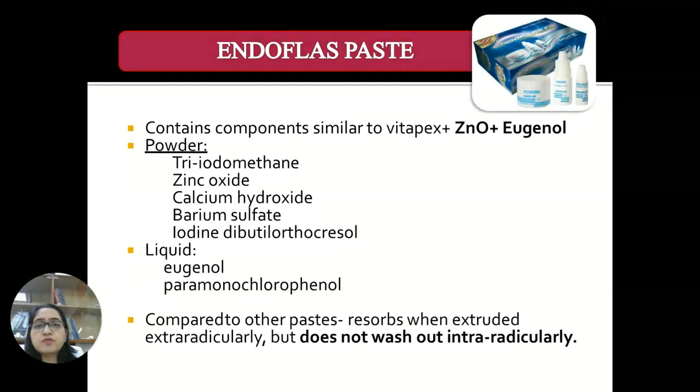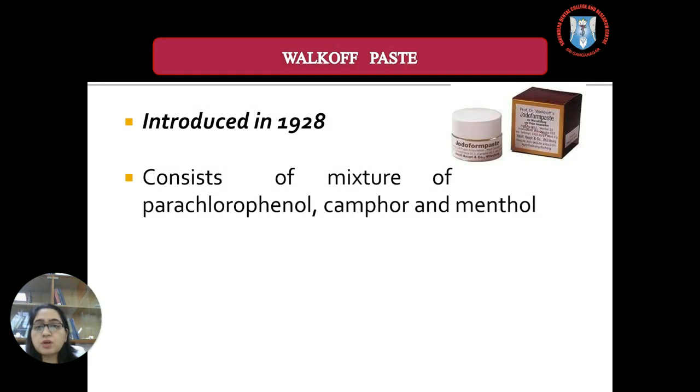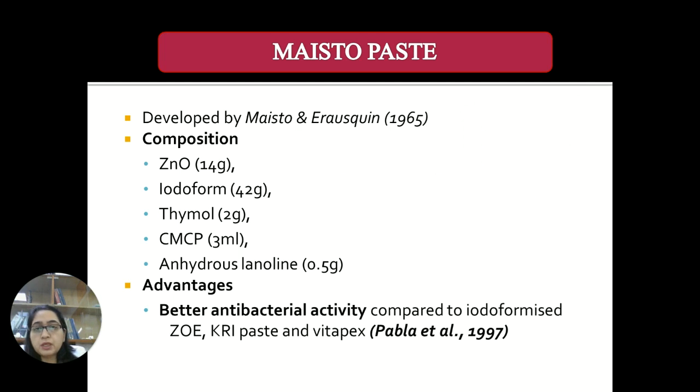The main disadvantage of Endoflas paste is the handling. It is difficult to handle, and once it sets, it cannot be pushed as Vitapex or Metapex can be. Another is Walkhoff paste, which was introduced in 1928. As discussed already, it consists of a mixture of parachlorophenol, camphor and menthol.